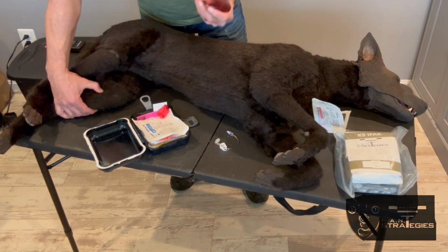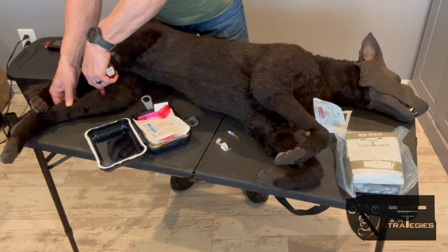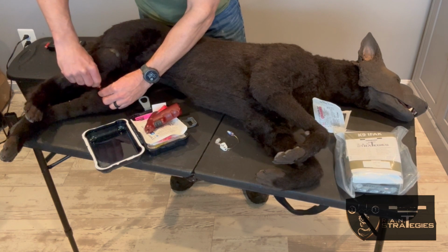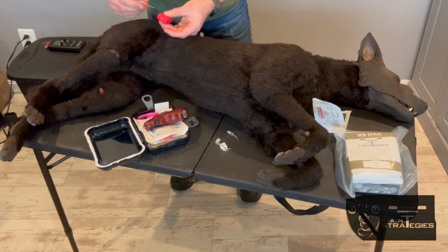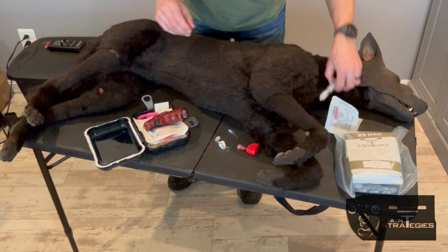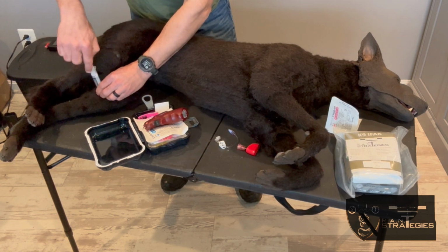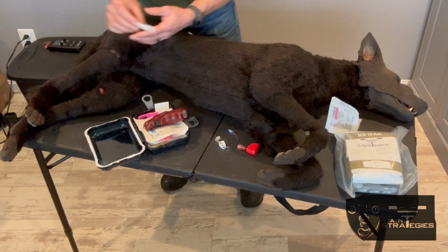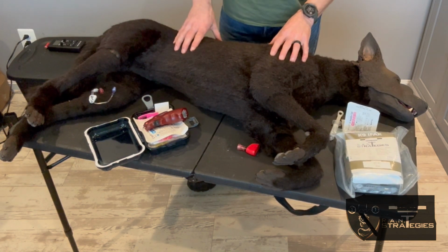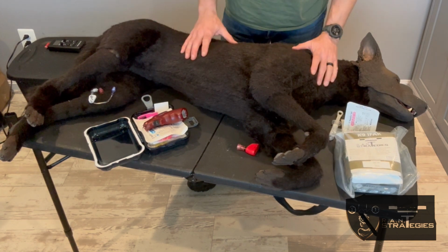Our drill would already be established. We have everything set up. We're going to just place it where we made the incision, squeeze the drill. It would go down. We remove our sharp, secure it. Again, take our syringe, confirm placement by aspiration of bone marrow, remove it, again attach our administration set, and then again we could do any medication, any fluid resuscitation we wanted to right through the IO route.